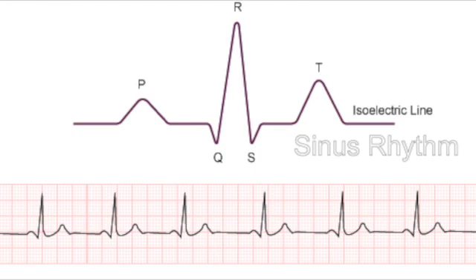So you're saying, okay, is this regular? Yes, it's regular, meaning there's a P wave before every QRS, and then there's a T wave that follows, and it starts again. The rate looks to be, let's see, between 70-ish? I was going to say 72-ish. Yeah, 70s, let's say. 71. Okay. 71, you want to be that exact, Michael? 71, yeah. Okay, so there you have it, right?